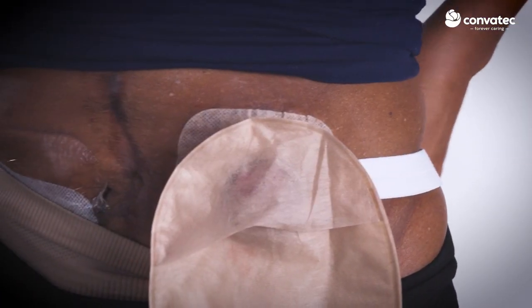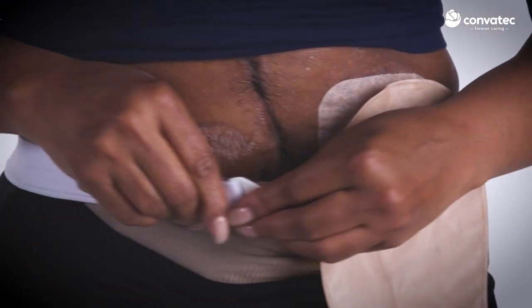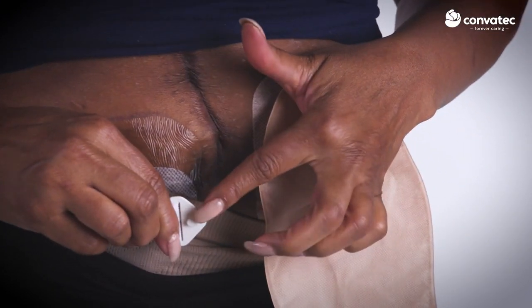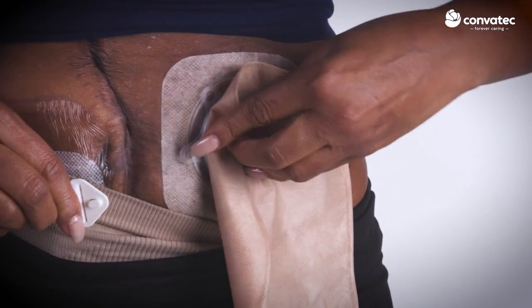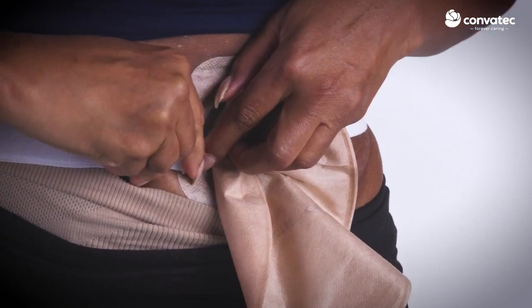Wrap the belt around the back of your waist. Adjust the length to the appropriate size of your waist so it fits comfortably — it should not be tight. Then stretch and attach it to the belt tab on the other side, again making sure that the belt tab is facing away from your skin.